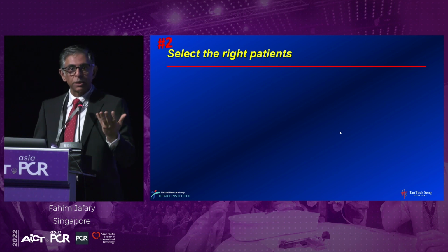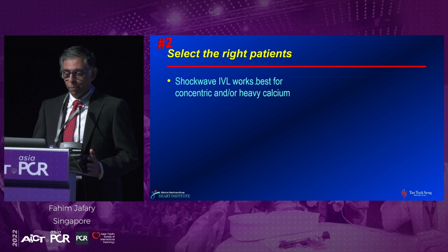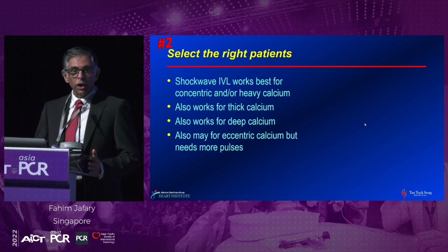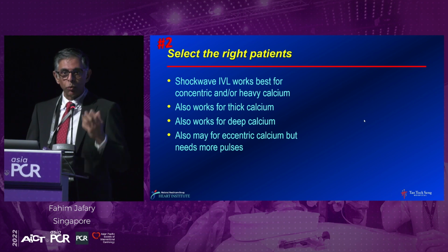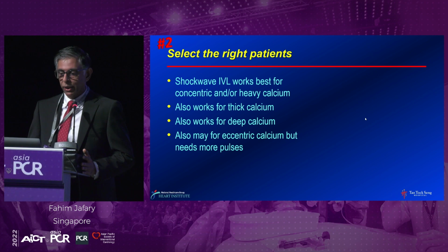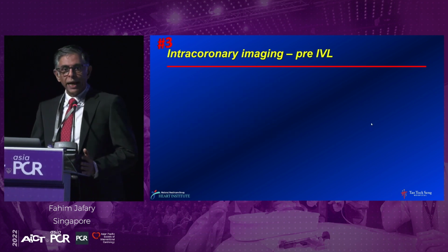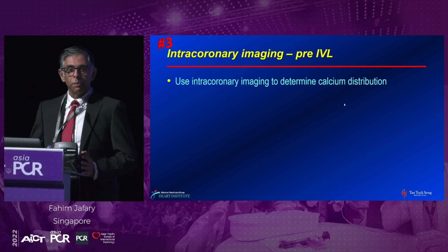The second principle of IVL is selecting the right patients, and IVL works best with concentric or heavy calcium. It also works for thick calcium. It also works for deep calcium, and may work for eccentric calcium also, but you may need more pulses. But the real value is it works well with the concentric calcium, and we saw several areas of concentric calcium over here.